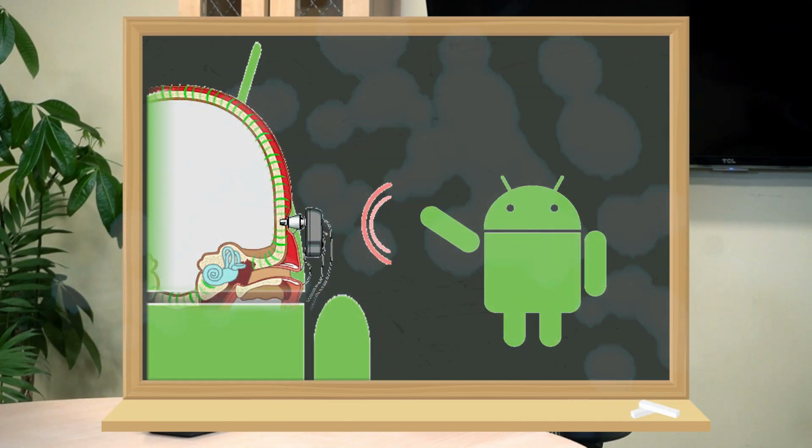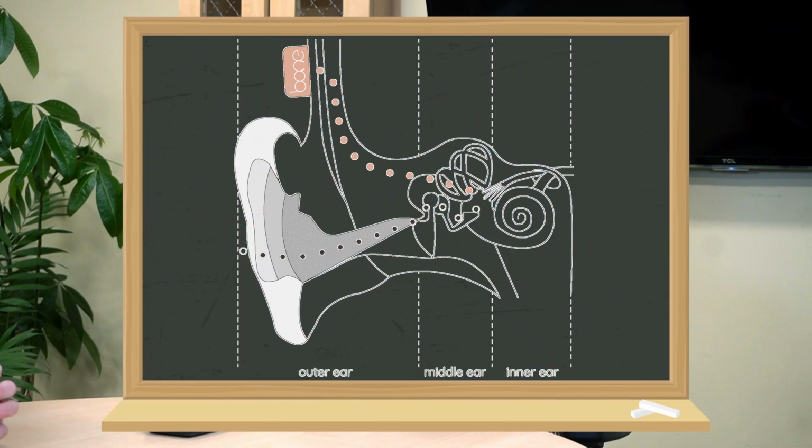Sure. Providing you have the Android phone, you can connect the headset via USB. And in terms of the headset design, it's a bone conduction design. So these are bone conduction headphones, and that means that they don't actually go over the ears. They actually sit on the jaw and conduct the sound through the jaw. Now, for myself, that's been working okay. But I know, Corey, that you've had some issues with bone conduction in the past, just in terms of hearing what is being said.